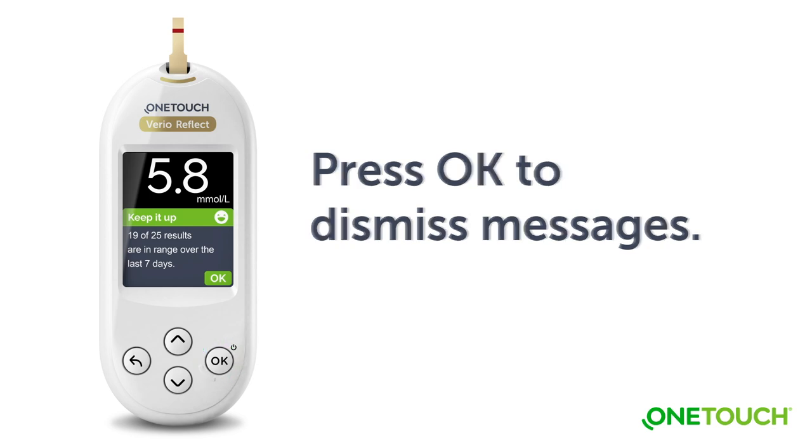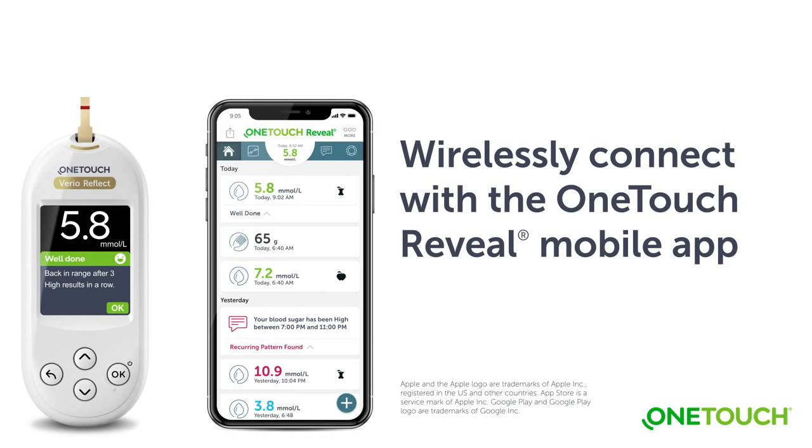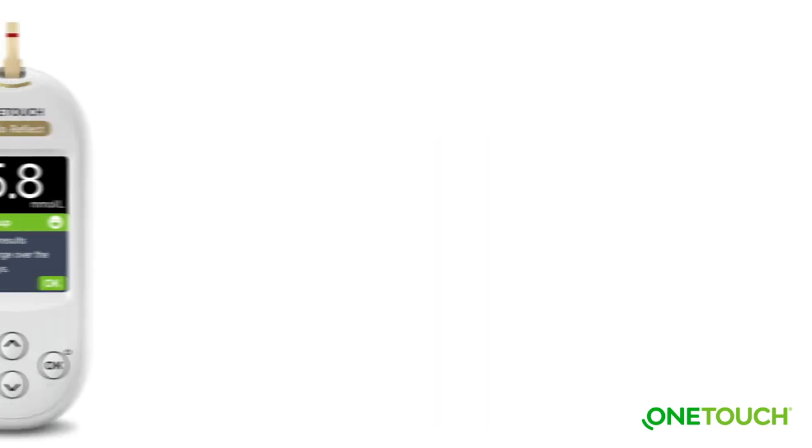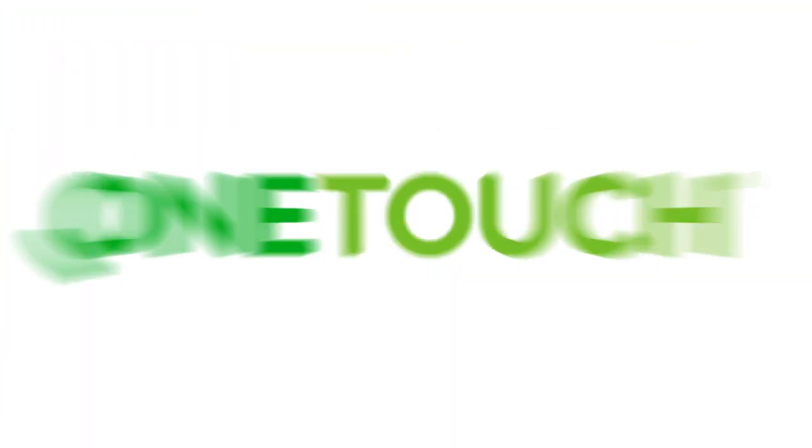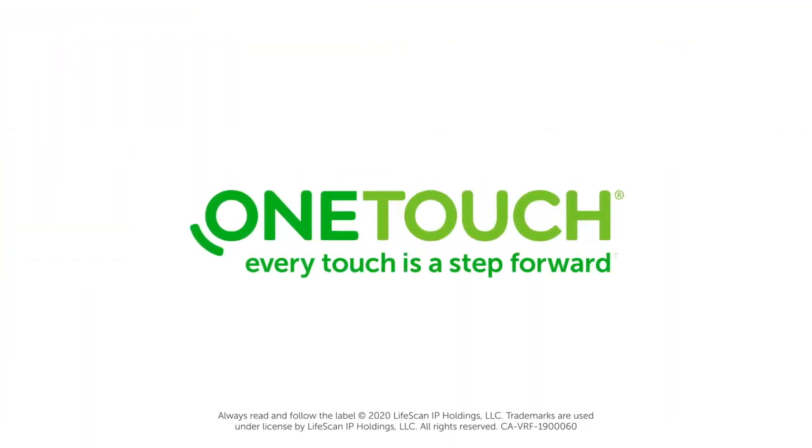Press OK to dismiss messages. The OneTouch VarioReflect Meter is designed to work with the OneTouch Reveal mobile app and other diabetes applications. Register your OneTouch VarioReflect Meter online today. OneTouch — every touch is a step forward.